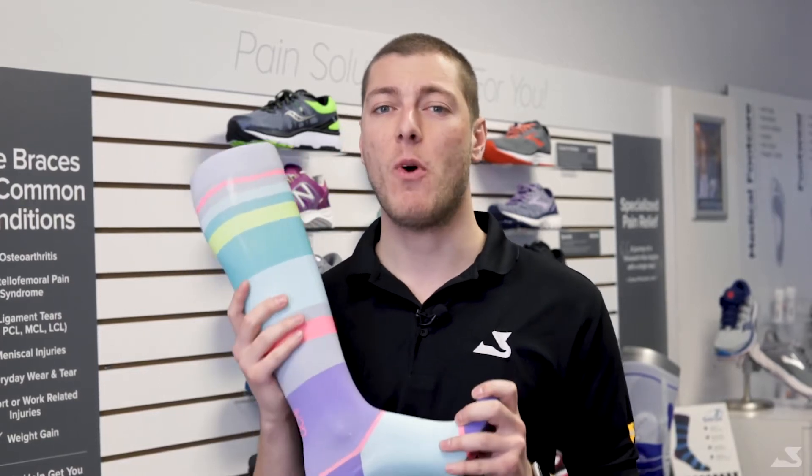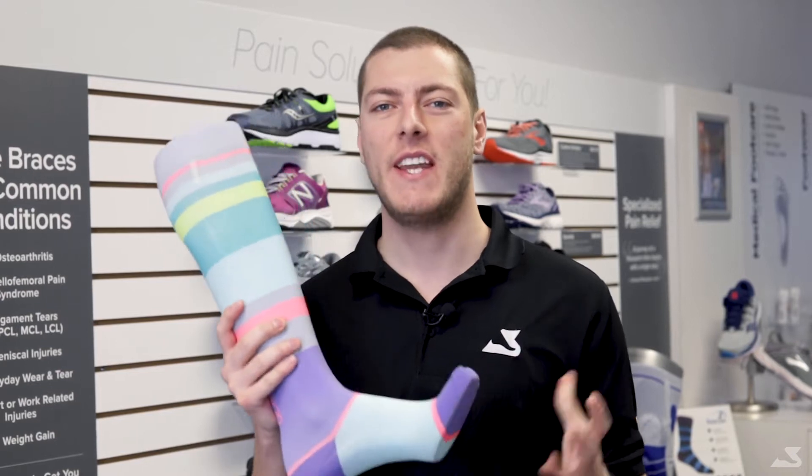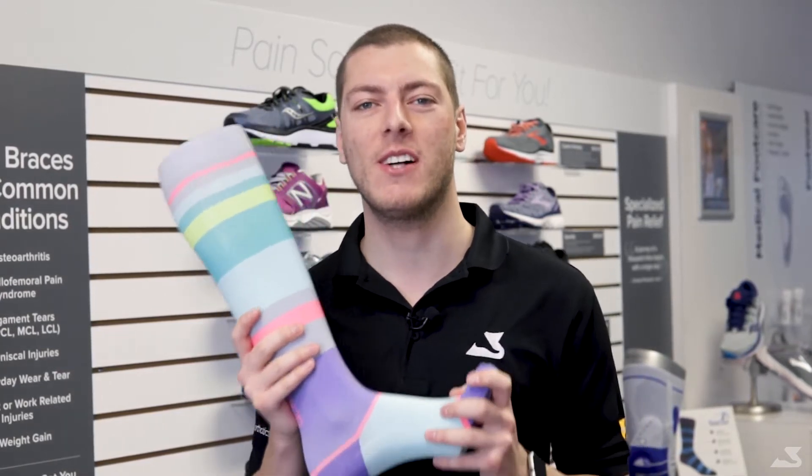Did you know compression socks need to be washed on a frequent basis to help the compression work correctly? Today, we'll show you how you can effectively wash your compression socks at home.